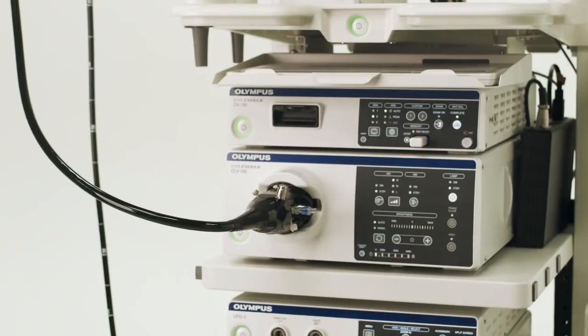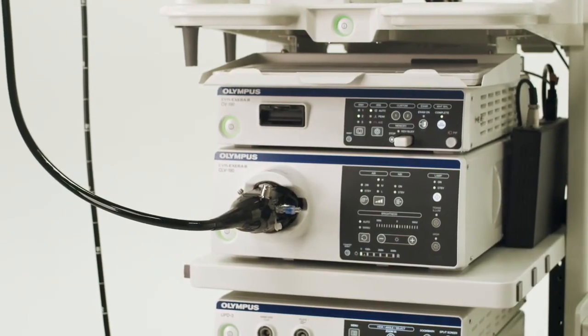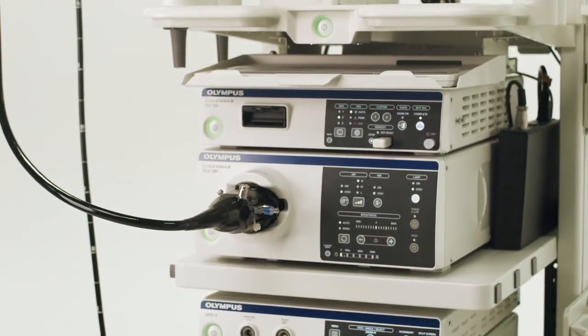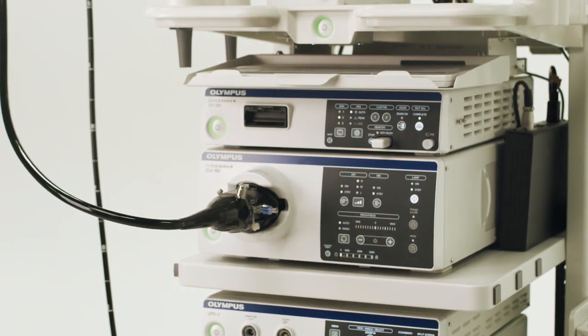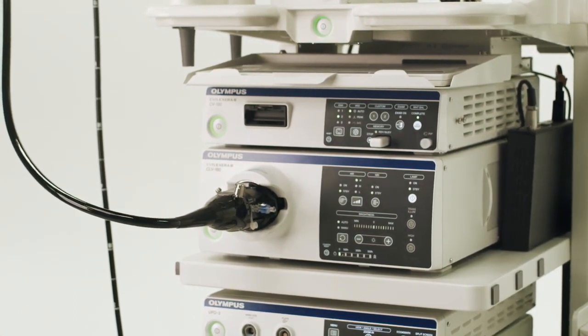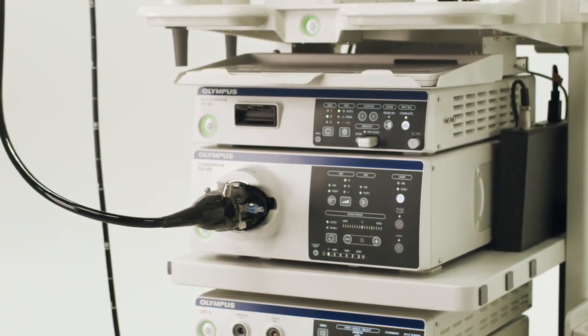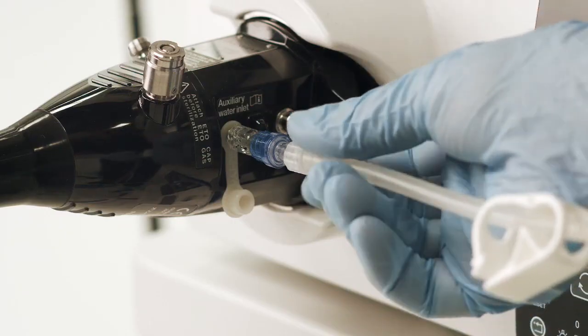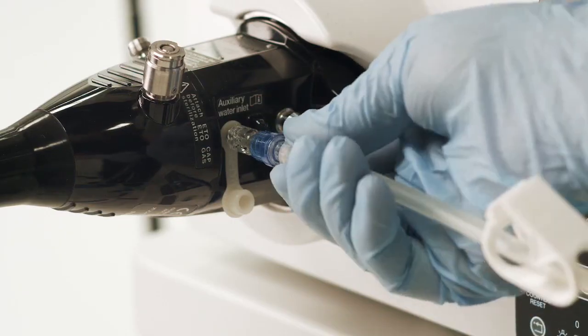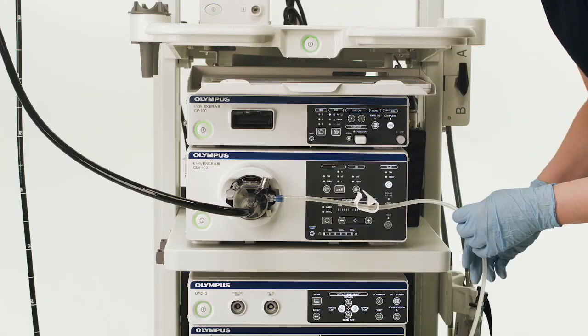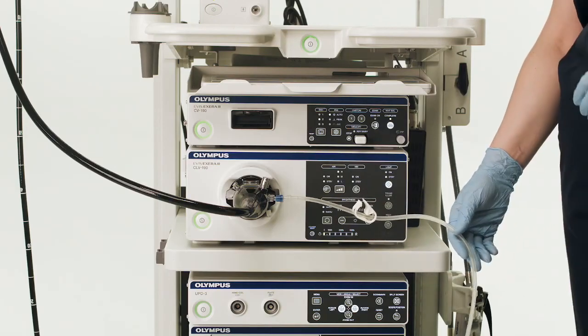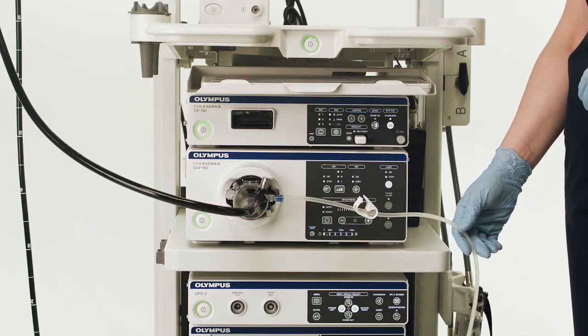This adapter will remain on the endoscope before, during, and after the procedure. The adapter should only be removed once the endoscope has reached the reprocessing location. Attach the MAJ 1651 tube set to the auxiliary channel adapter on the endoscope, turning one component onto the other ensuring a tight fit.